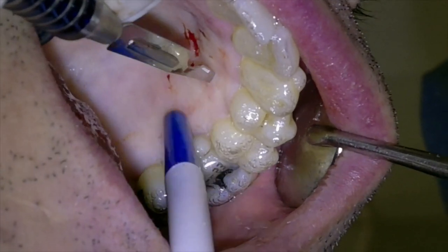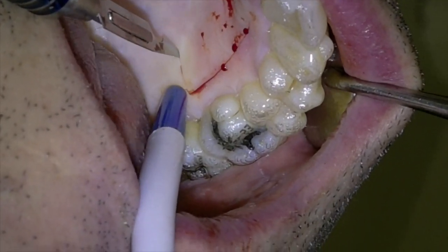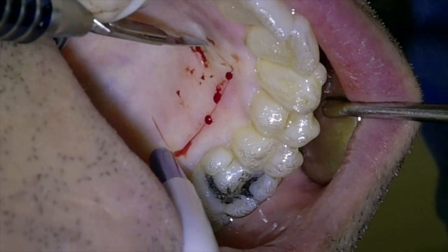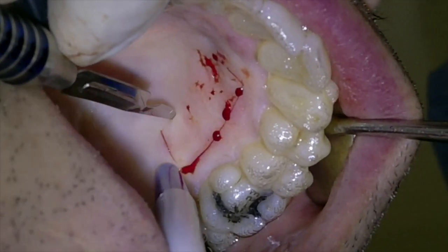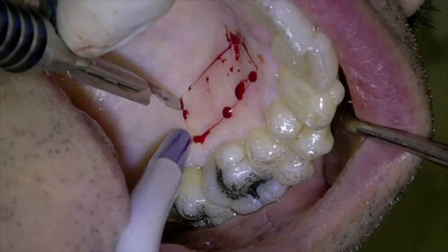As you can see, I'm starting on the distal of the molar because it's enough. And my depth is going to be about 1 millimeter, no more than that. I'm going to start with the horizontal line, mesial and distal line, and at this point you can either do a very superficial apical incision, or you can avoid that apical incision to avoid bleeding until the end.